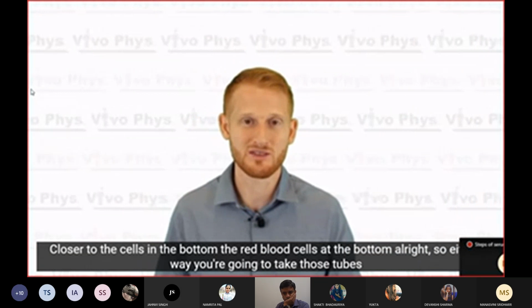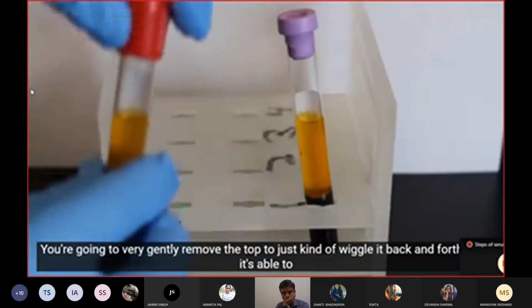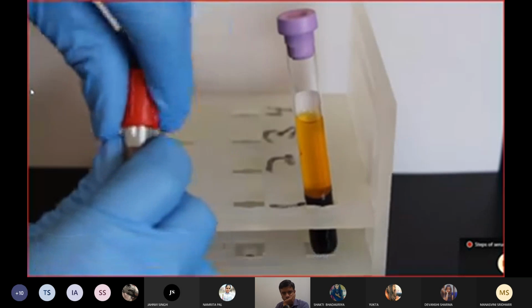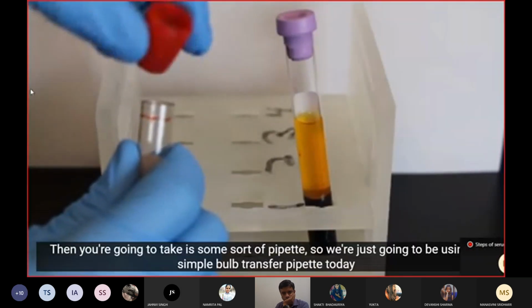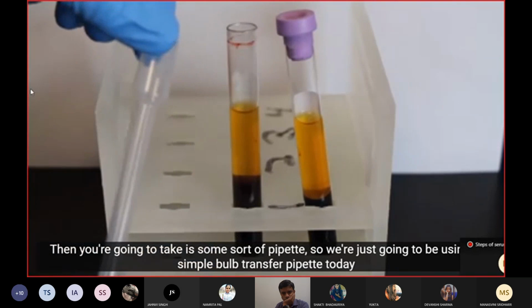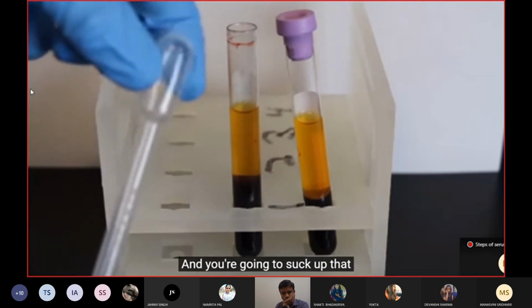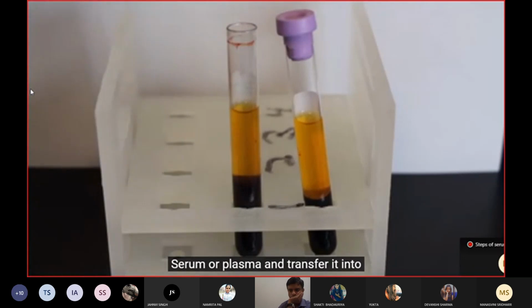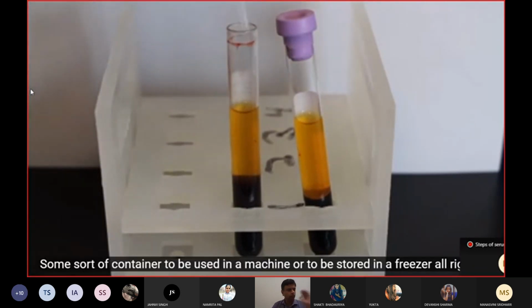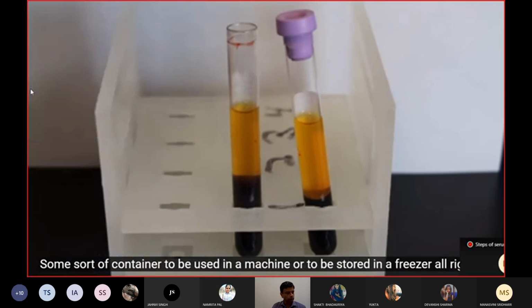All right, so either way, you're going to take those tubes, you're going to very gently remove the top, so just kind of wiggle it back and forth until it's able to pop off. And then you're going to take some sort of pipette, so we're just going to be using a simple bulb transfer pipette today, and you're going to suck up that serum or plasma and transfer it into some sort of container to be used in a machine or to be stored in a freezer.